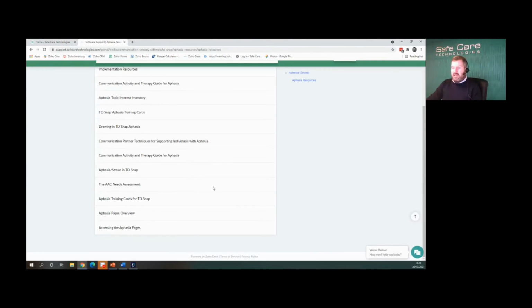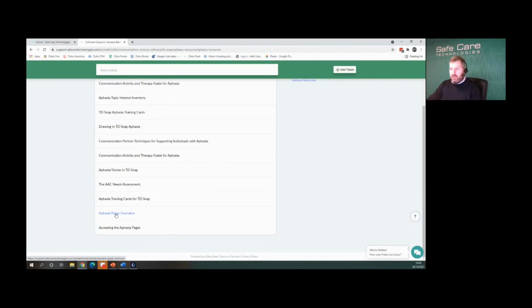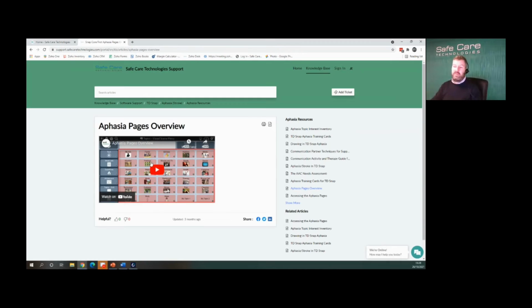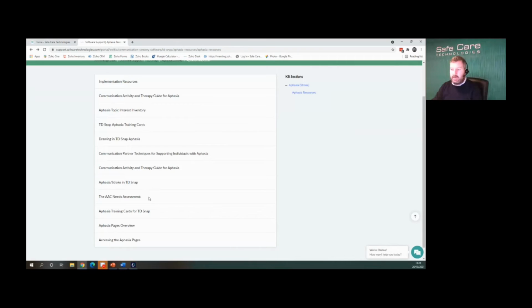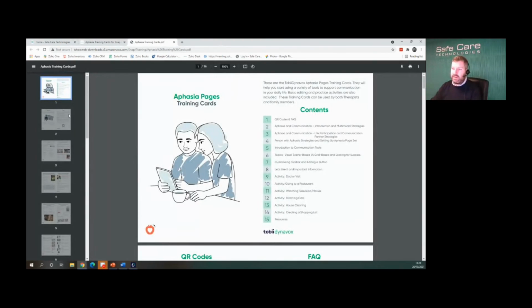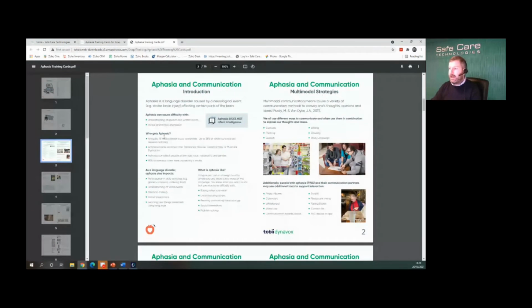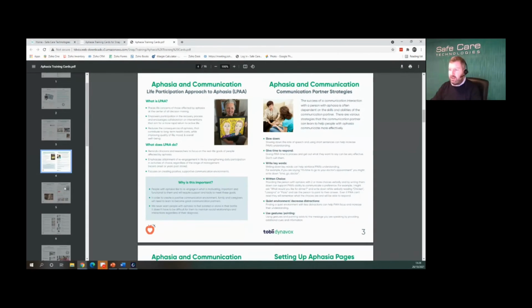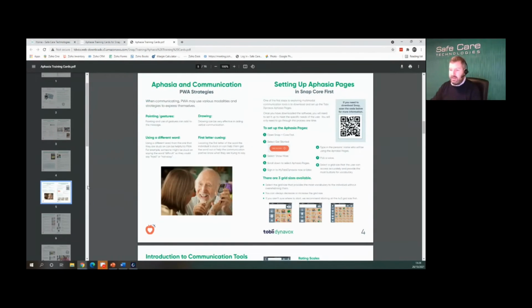different resources, anything from an overview. So I think we have a YouTube video there giving you just a brief 5-minute overview of the different features within it. To the training cards. So the training cards are literally how you set it up, where you find it, an introduction to it, multi-modal strategies, communication partner strategies, and setting up the aphasia page set, and so on.